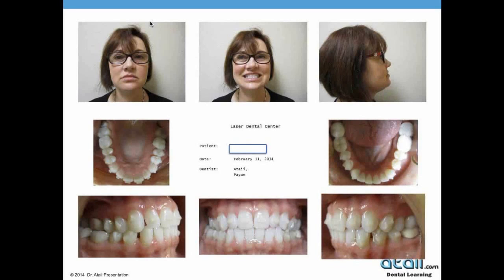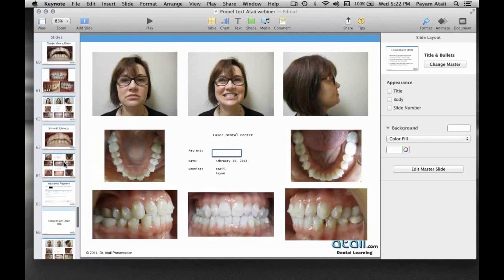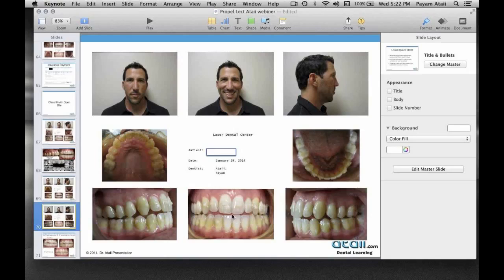I've had cases, like you saw in that class 3, where I had to continue giving the patient additional Propel, and that's why you saw the attachments removed. So in some of the cases, you want to get those extrusions down, you may have to do one more treatment of Propel. You don't want to do it prior to 10 to 12 weeks. You have to do it after the 10 to 12 week time period.